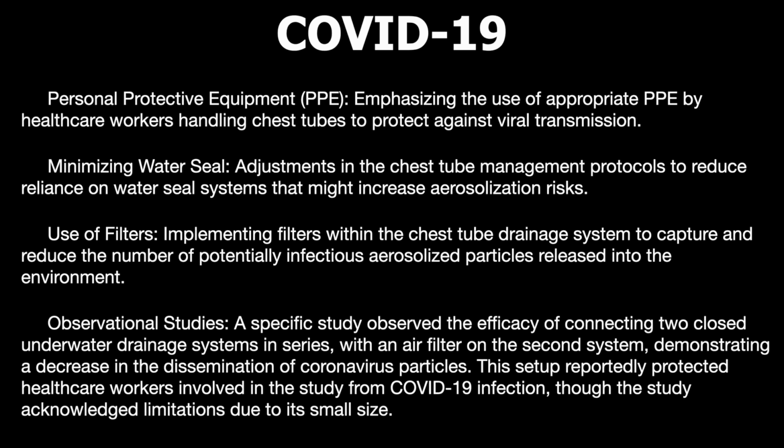A specific study compared the efficacy of connecting two closed underwater systems in series with the air filter on the second system, demonstrating a decrease in the dissemination of the coronavirus. This setup reportedly protected healthcare workers in a study in COVID-19 infection, though the study acknowledged the limitation of having a small size.